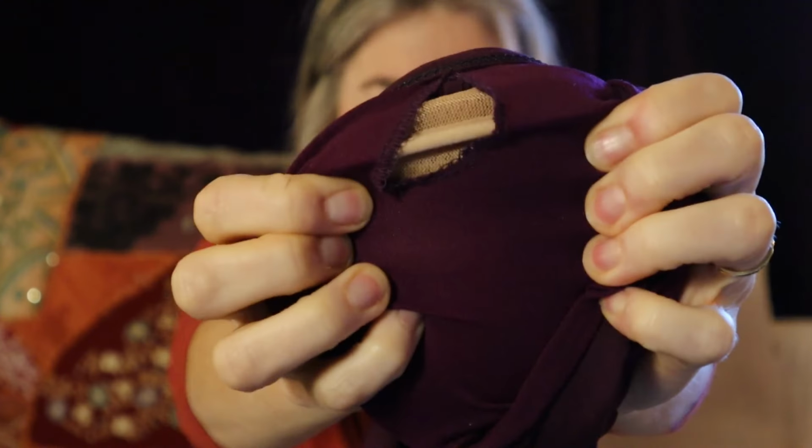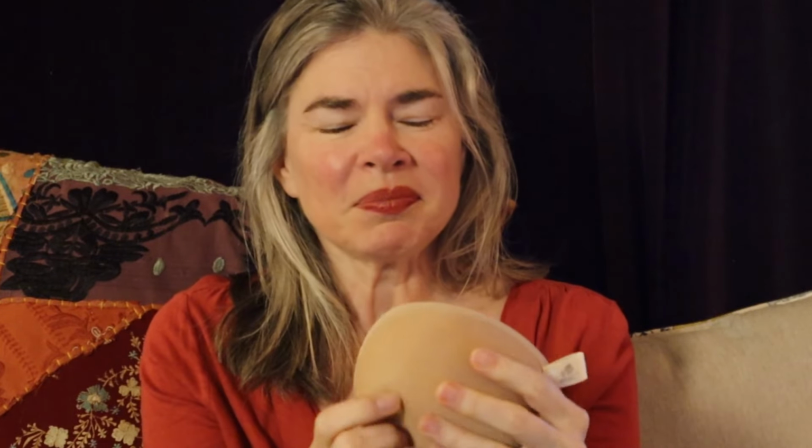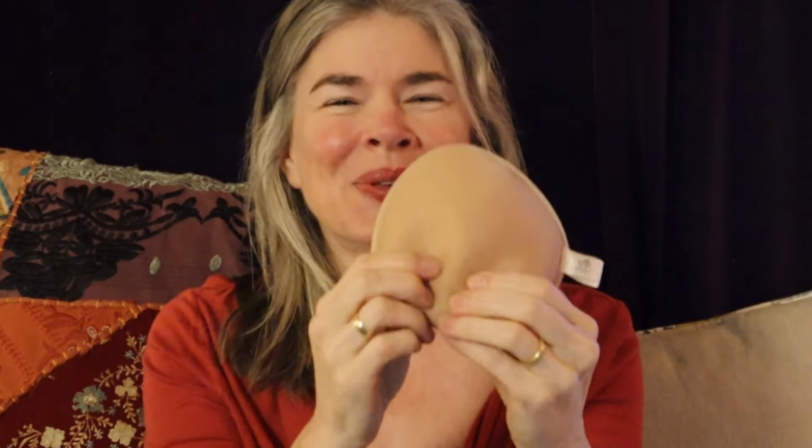And it does have a little hole. I'll show you the little hole that it has to put a prosthetic, or usually what it comes with is just one of those kind of shells, just very, very light nipple guard. But I took those out, and it took me a few minutes to stuff this prosthetic in, and I would not have been able to do so if it was made of silicone. But because the internal filler is little plastic beads, it's a little bit more malleable and squishable, and when I feel what the beads feel like, they are round and they feel just like BBs from a BB gun.